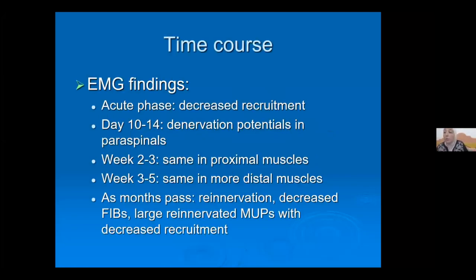When I started my presentation, I said I can time the lesion. When did this lesion happen? There's a certain timeline or time course. EMG findings can be done at any point of the problem. I will, of course, have a referral from the referring doctors.